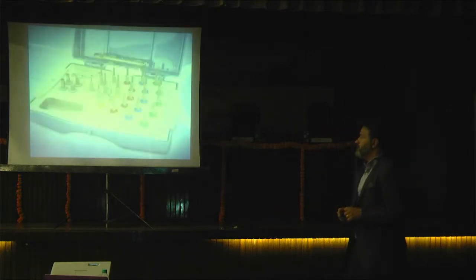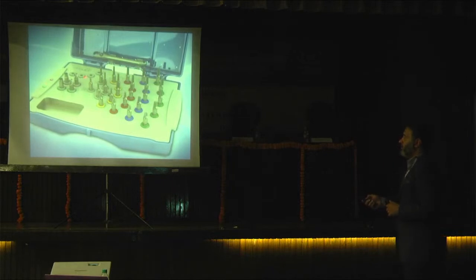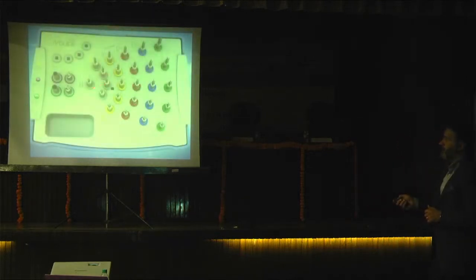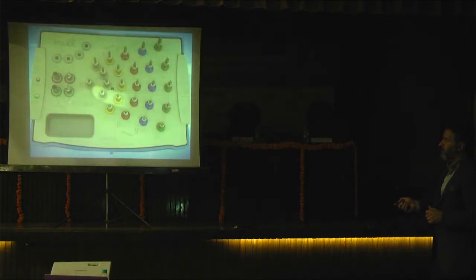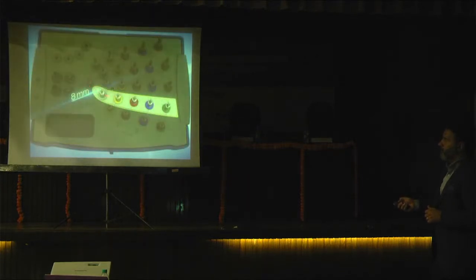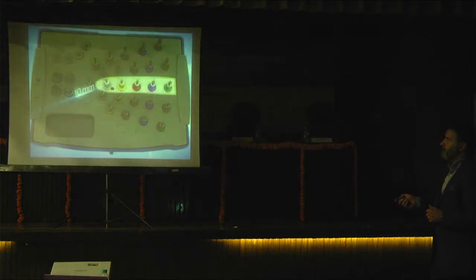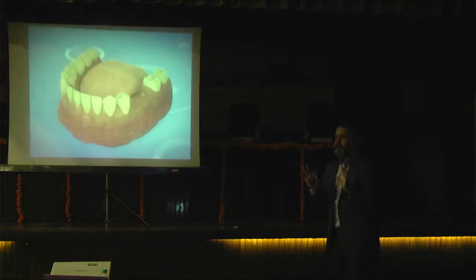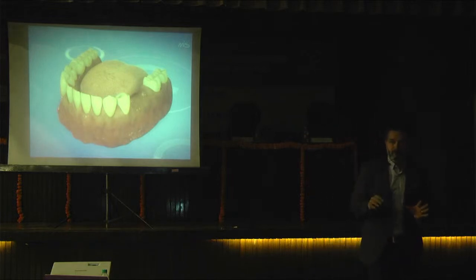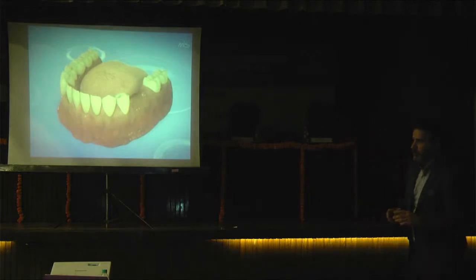Okay. So, we have a starting drill here, and we have some pathways. The 6 millimeter, this is the protocol. You should use it one by one. This is the pathway for 10 millimeters, 11.5 and 13 millimeters. If you follow the protocol, it is very easy to place an implant. Let's watch the movie to place an implant.